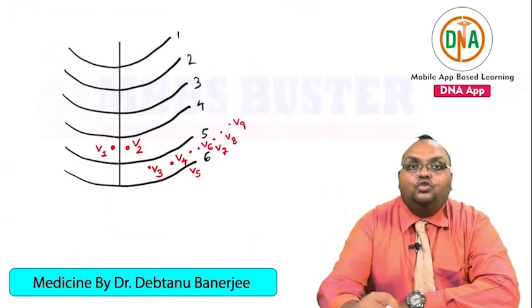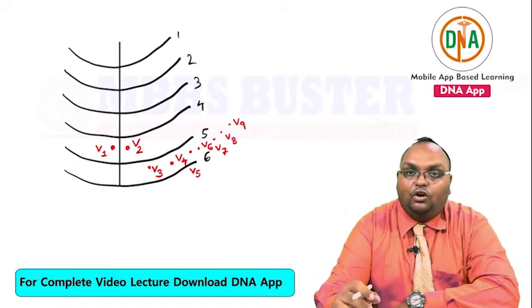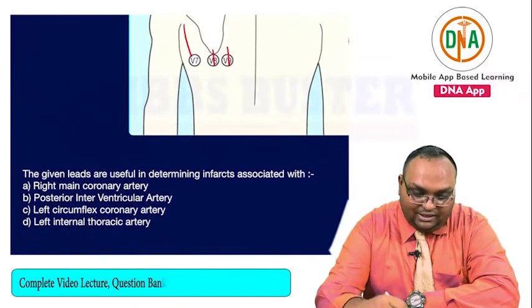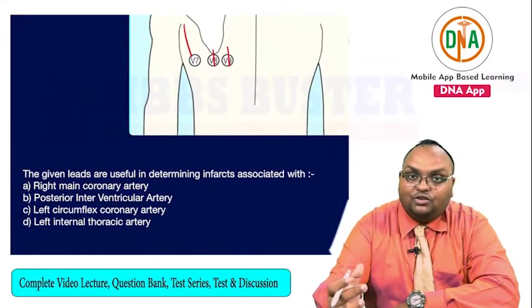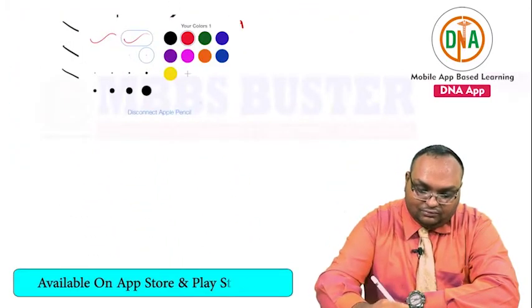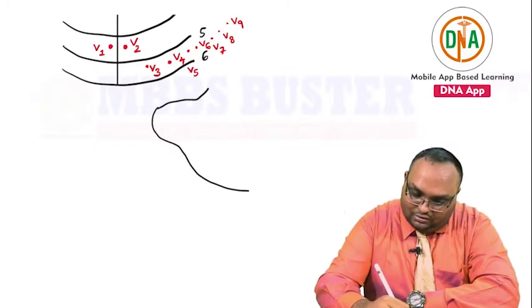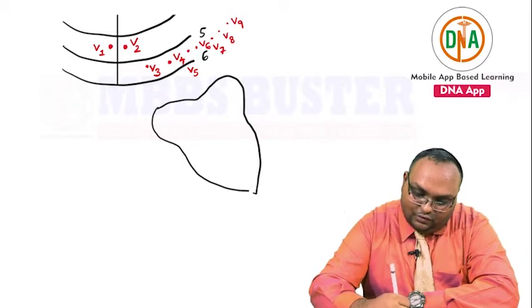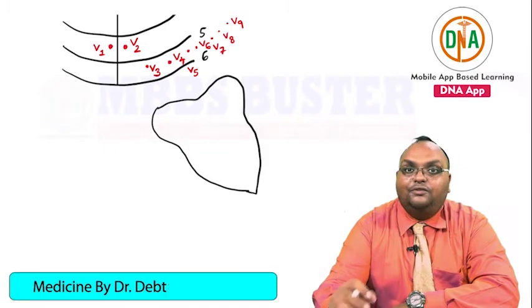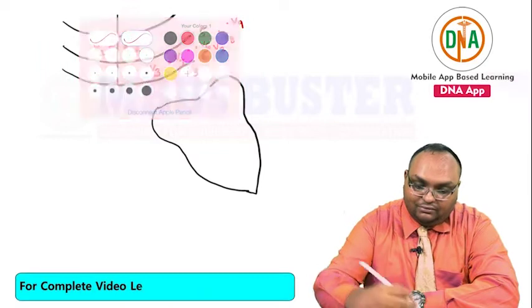Now the question has asked you which of the following arteries might have been affected, or a pathology of which of the following arteries has been indicated by the following leads. Infarcts associated with. So you need to know the blood supply of the heart. And then we need to compare the different leads which represent or are associated with the different surfaces of the heart. So let's have a close look at it.